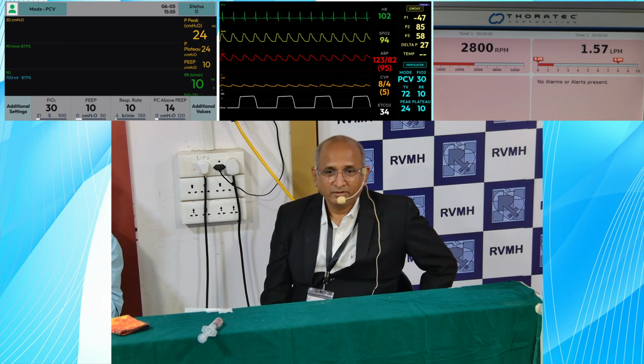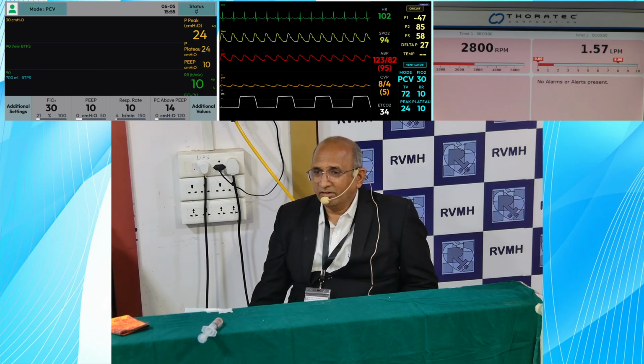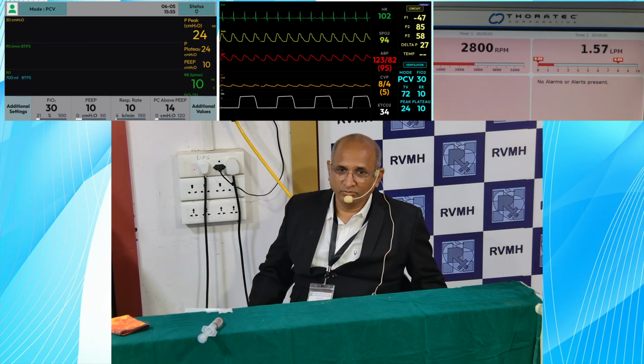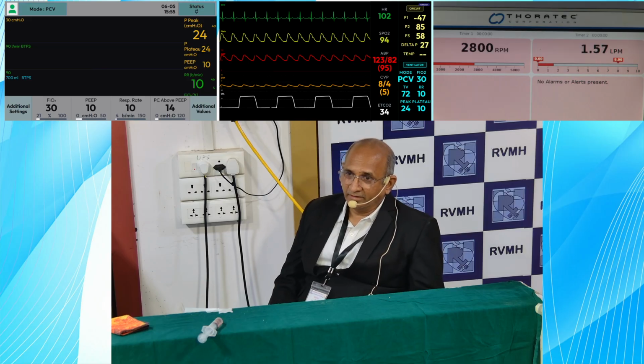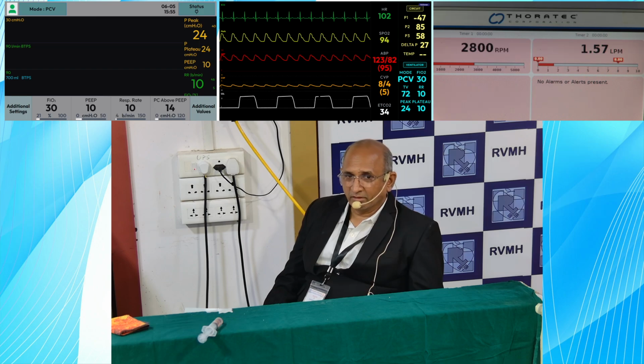Okay. So now this is the same child, a 10-year-old child. He has a case of multiple sclerosis on immunosuppression therapy, developed pneumonia, and post pneumonia he went into ARDS. The PF ratio was low and he was required to be put on a ventilator. On the ventilator, the PF ratio remains 68. So he was counseled for ECMO and ECMO was initiated. Today is day 5 of ECMO.